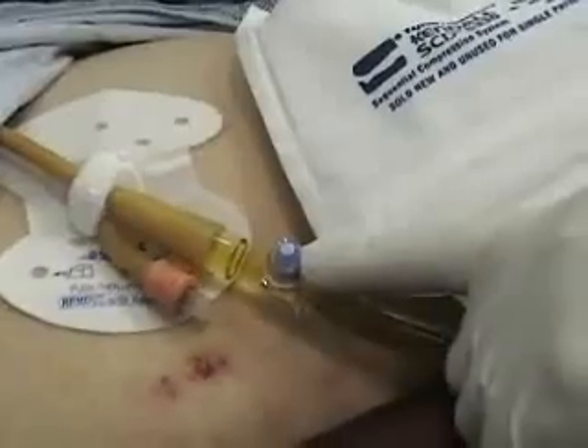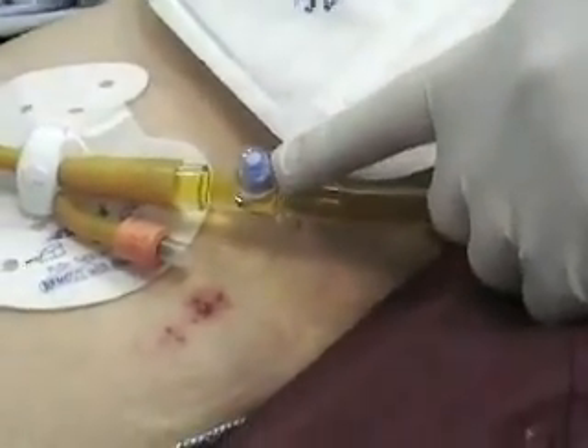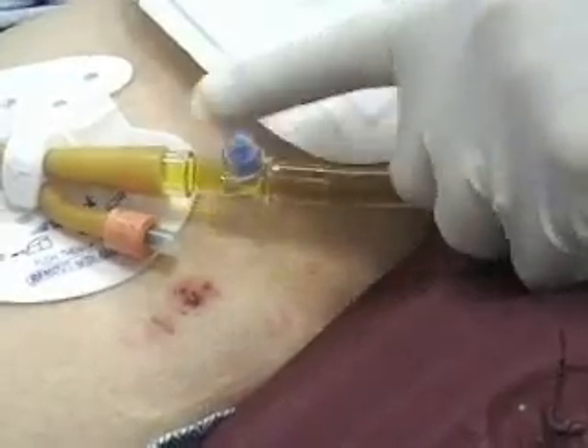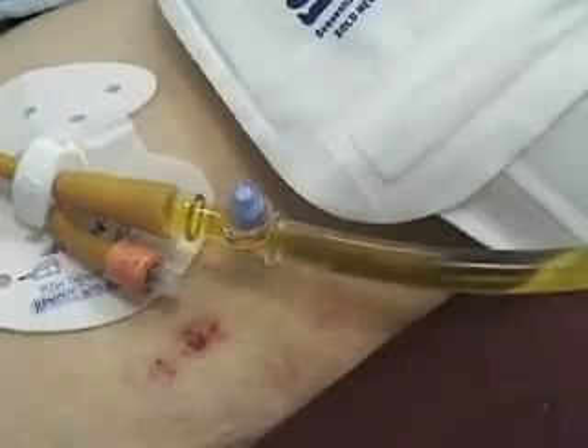This port right here is a place where you would draw a specimen for a urinalysis or a urine culture. You would clean it with alcohol and then draw with a syringe and send that to the lab.